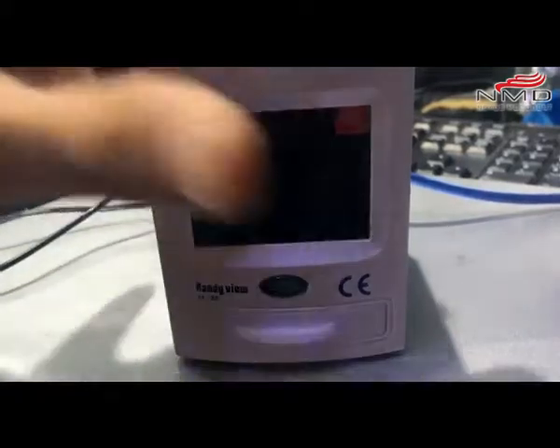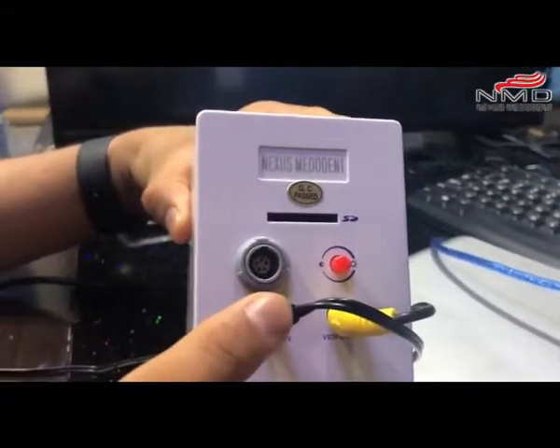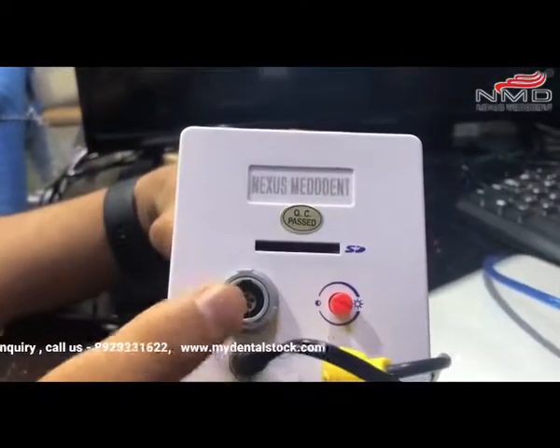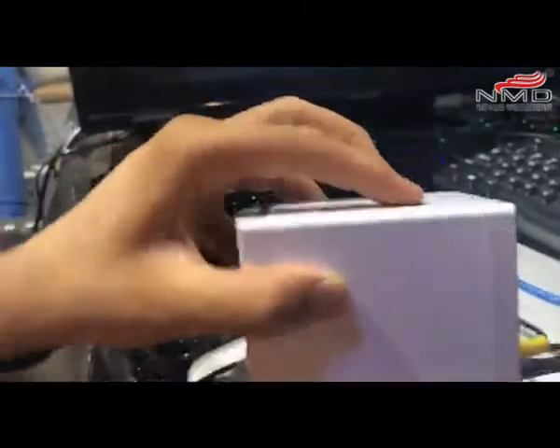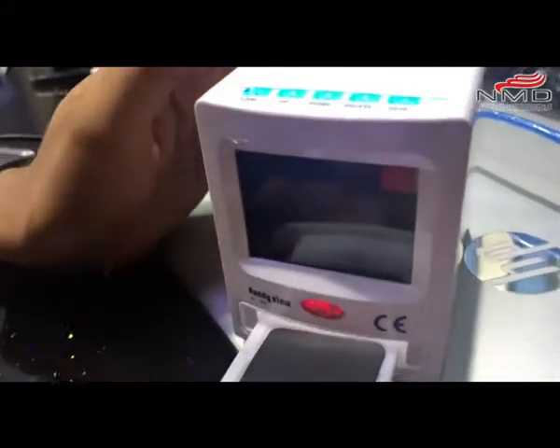All you need to do is connect the power cable. This is the SD slot, and you can also connect your camera. You can see it over here, and this is the VGA output and video output. I have an X-ray film already inserted.